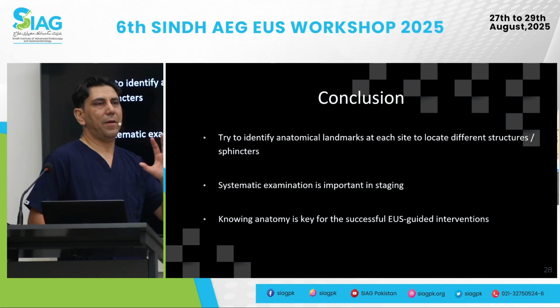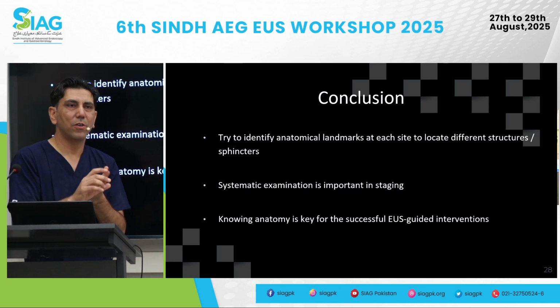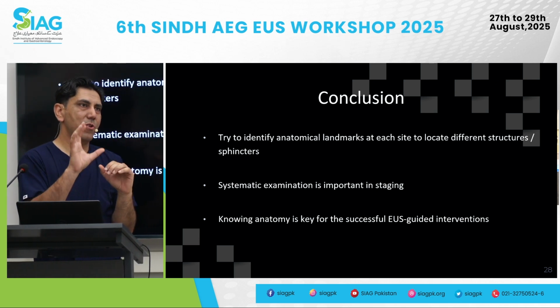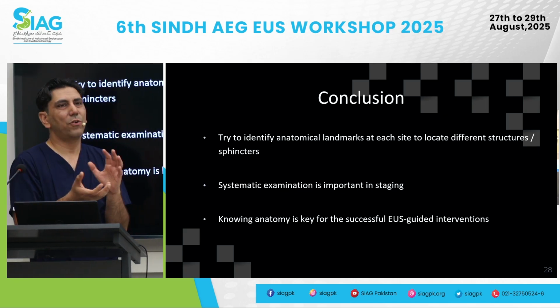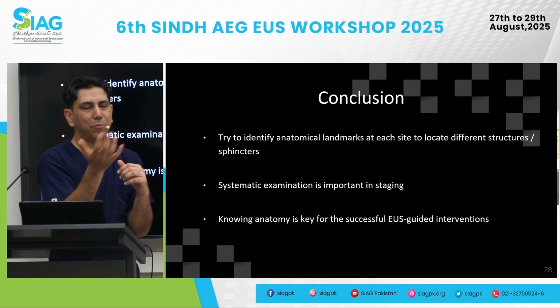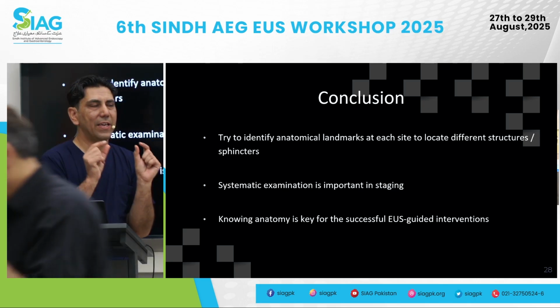So as I said, having a pattern in your mind of how to approach these patients, why we're doing it, what the clinical utility is, and a plan to approach. Then try to identify, keeping it in the 3 rectal stations and 1 anal station, the organs anteriorly and posteriorly. There is only a slight difference in male patients in terms of what's anterior and posterior; both remain essentially the same: the coccyx, and then focusing on the muscle layer.